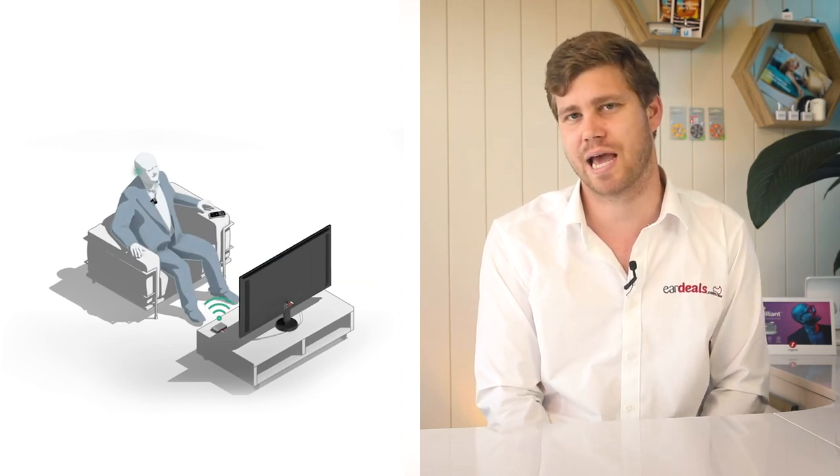The Streamline TV gives you the ability to direct audio from your TV directly into your ear canals through your hearing aids. For those who watch TV with a significant other, it means less arguments — you can listen at your volume while they listen at theirs. Our EarDeals brokers can help you choose the best accessory for your scenario and provide written documentation and brochures, so rest assured there are accessories within the Signia range that can assist you.